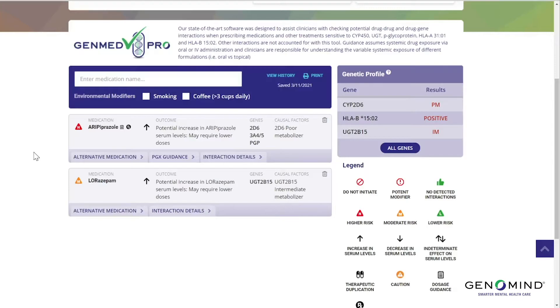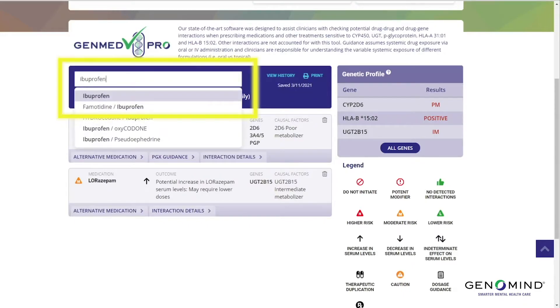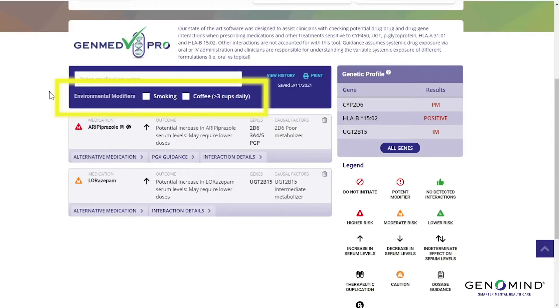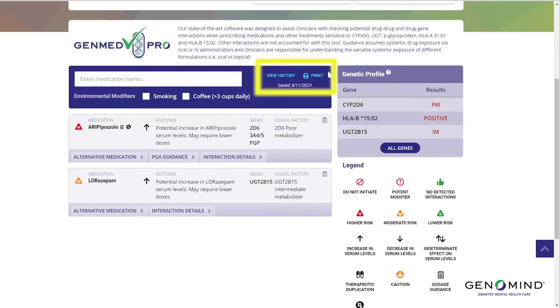Let's start by looking at the basics of the layout. Any drugs you entered in the patient's digital requisition form will automatically be included, but if you did not include medications or need to retroactively add medications, you can simply add or remove them in this field here. Below this, you'll notice these check boxes for environmental factors, smoking and coffee consumption. We also provide an option for you to print or view the history of your entries.